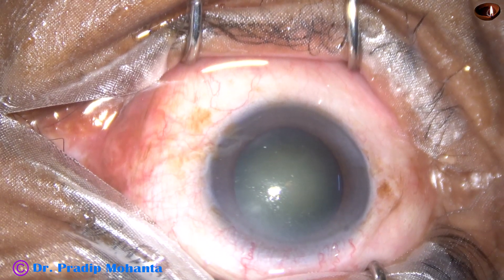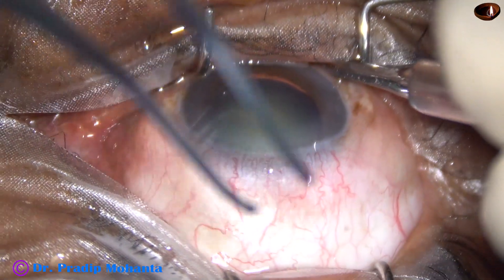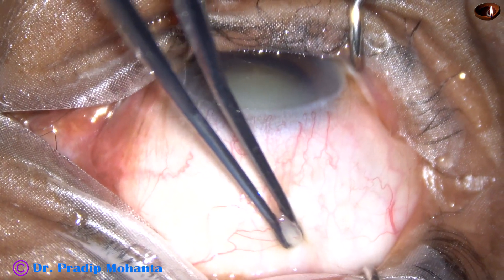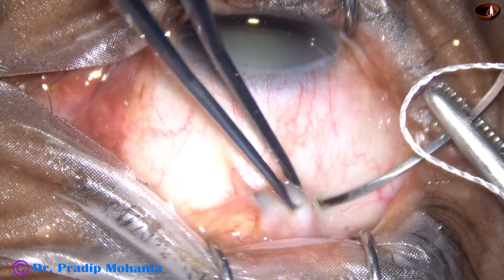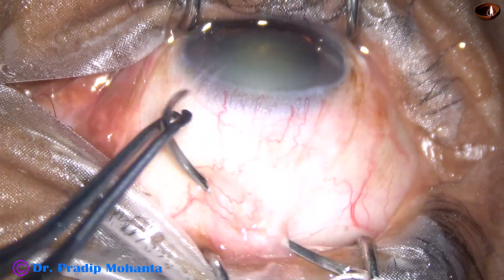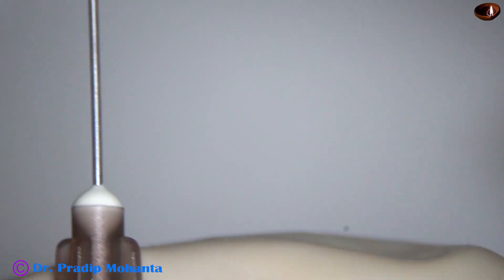Superior rectus bridal suture. Use a muscle hook in the inferior fornix. The eyeball goes downward. Hold the superior rectus tendon. Take a curved needle and pass the superior rectus bridal suture in this way. Wash this step several times and you will be able to do it.